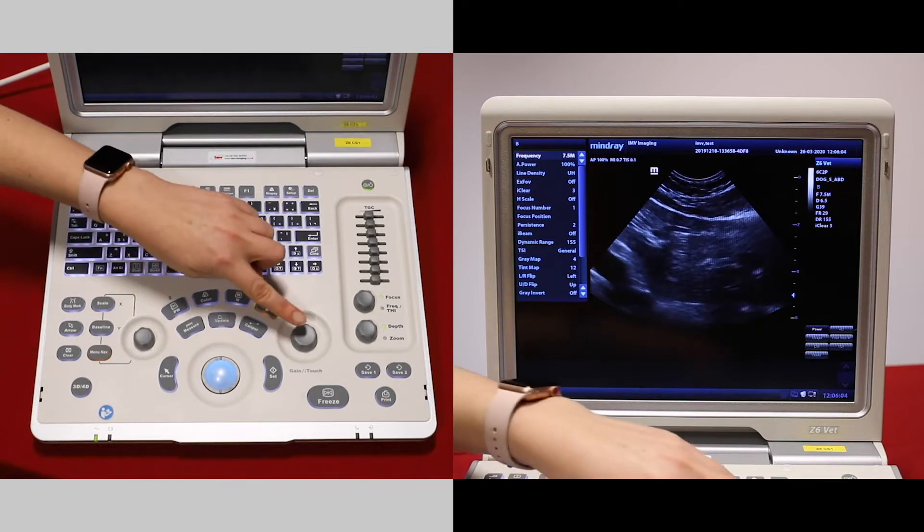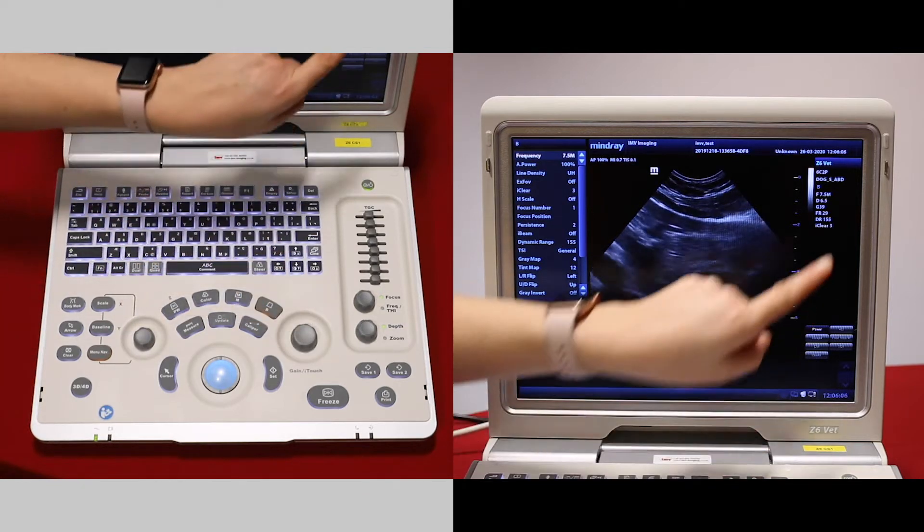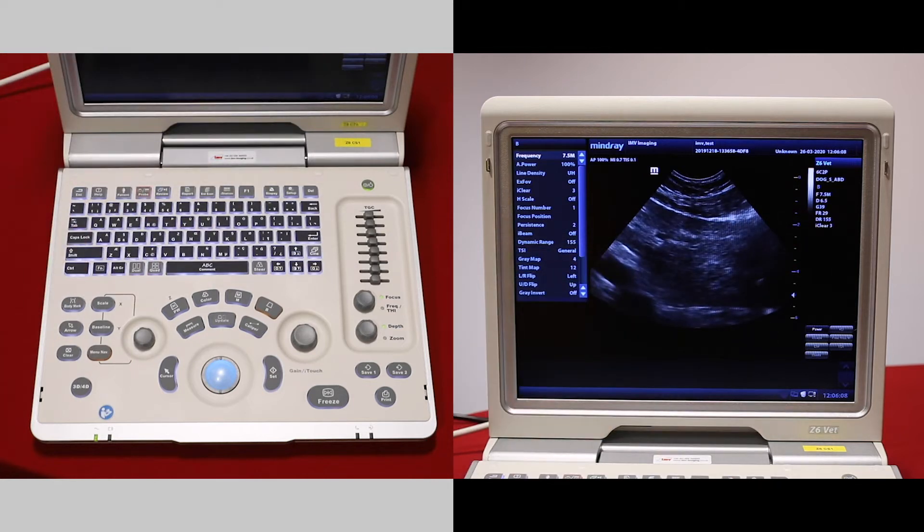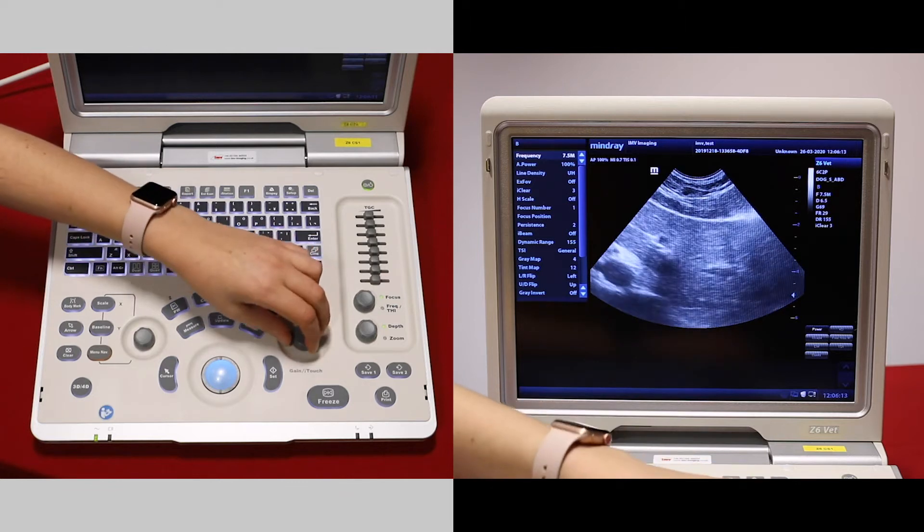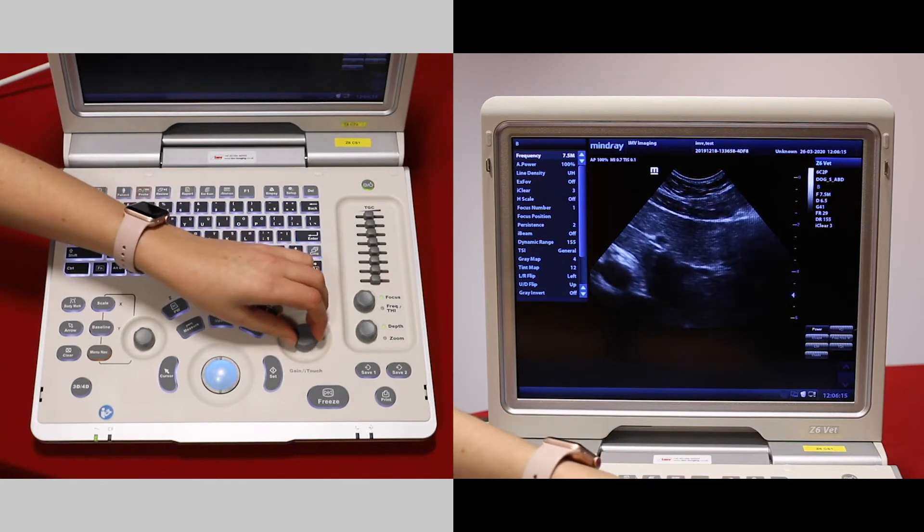The gain can be adjusted with this button here. It also tells you on the screen what our gain is. Increase it to increase overall brightness and decrease it to reduce brightness.